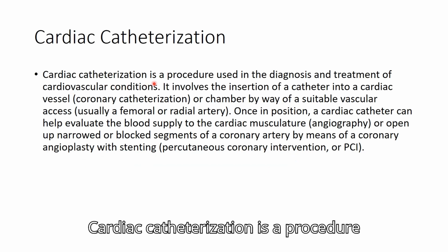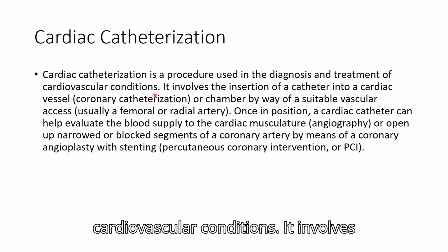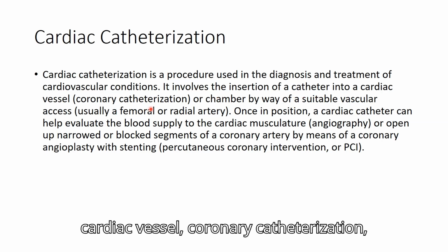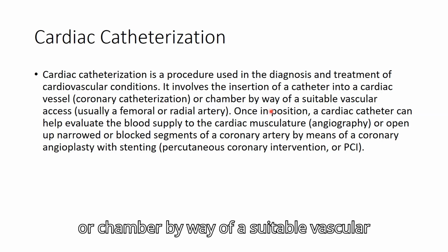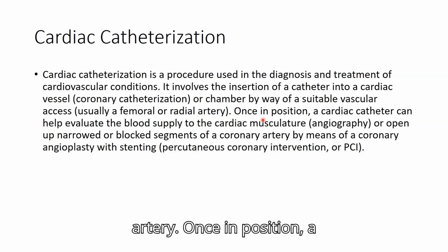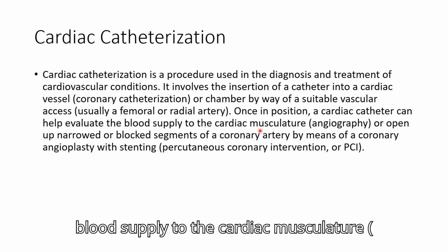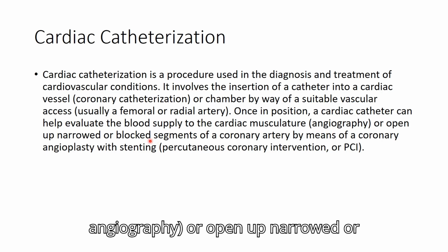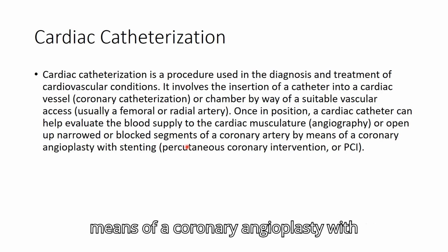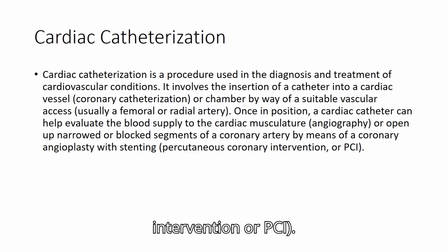Cardiac catheterization is a procedure used in the diagnosis and treatment of cardiovascular conditions. It involves the insertion of a catheter into a cardiac vessel (coronary catheterization) or chamber by way of a suitable vascular access, usually a femoral or radial artery. Once in position, a cardiac catheter can help evaluate the blood supply to the cardiac musculature (angiography), or open up narrowed or blocked segments of a coronary artery by means of a coronary angioplasty with stenting, percutaneous coronary intervention or PCI.